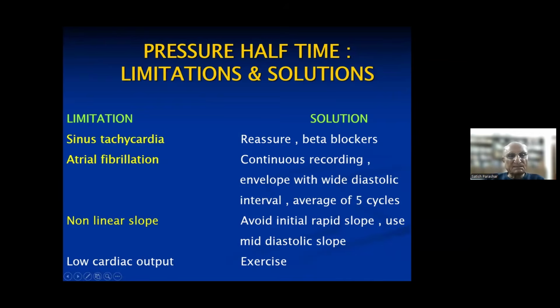Now there are certain limitations. I will not tell you all the limitations. I will tell you the limitations which we see in our day-to-day life. There's no point in telling you many of these things, you will learn later on, not now. These three are the most important problems which we face in our day-to-day practice.